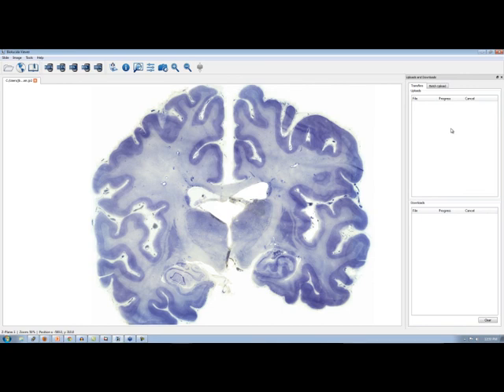That's one difference. The other small difference is when you upload images, if you remember the first method using the upload icon, we entered in a bunch of information, like notes, description, collection, objective, all that. Tags. Using that method, you upload the image with all the information. However, using either the batch upload or track directories, you actually just automatically have images added to your work area. So at some point later, you need to go back in and actually edit those and move them to the collection you want. Great. I think that makes a lot of sense.